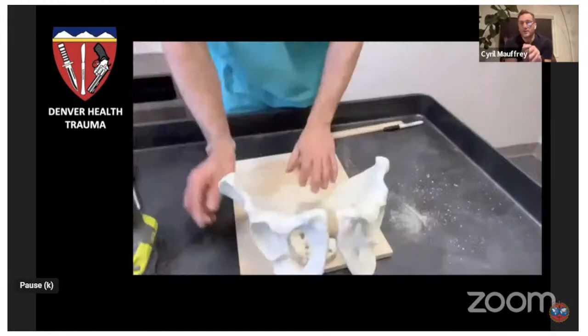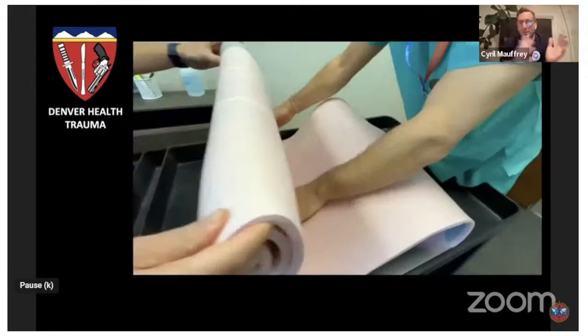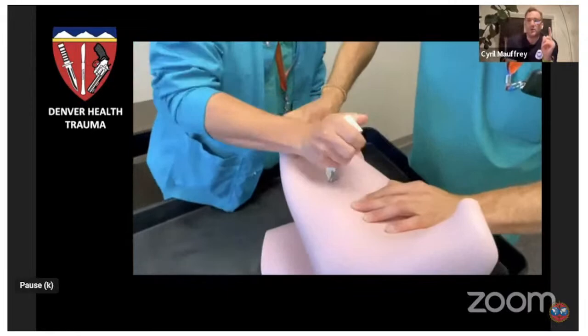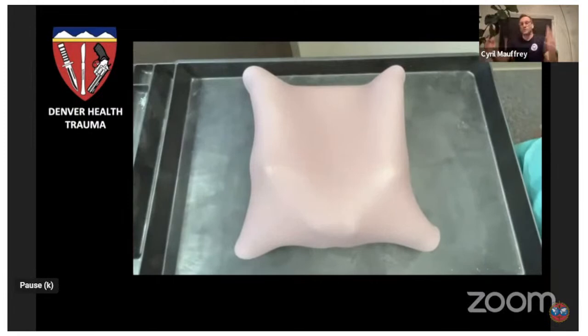And if you go to the website that I named earlier, theorthoacademy.com, I had someone, a coder, create an algorithm where you can look at your performance using this model. So how long does it take you to get one screw in and any screws in the pelvis? And how many breaches? How often do you get out through critical structures? And you can monitor your progress in time, but also compare your performance to other surgeons who are using the same tool. So it's a great little, very realistic. In fact, the publication is coming out validated by other pelvic surgeons.